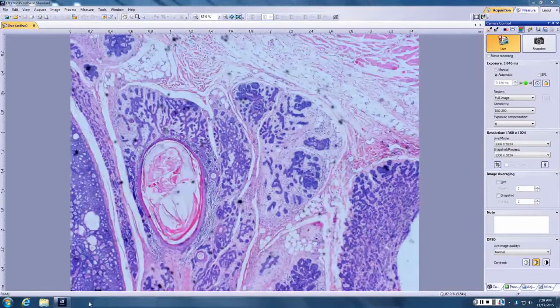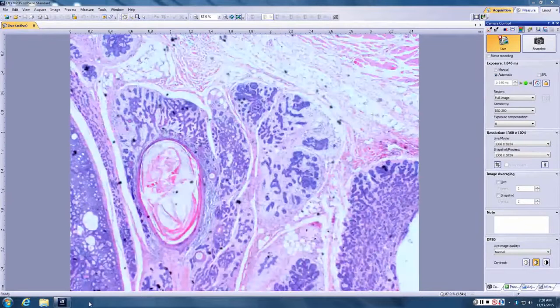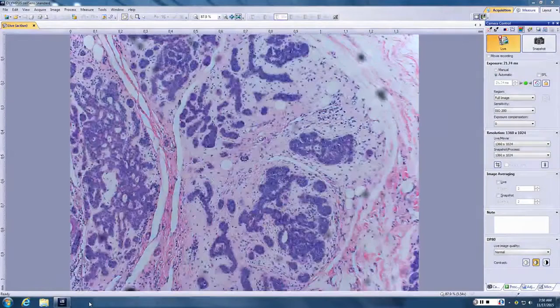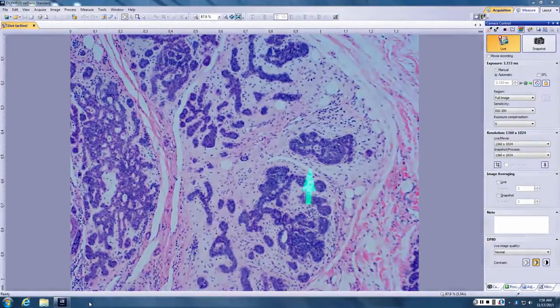Some of the areas have the spectacle look of a trichoadenoma, but when you look at the stroma, is it myxoid or is it concentric fibroblast rich? I think that it's fibroblast rich, concentric. I'd say this is one of those rare cases where it's not the second choice.